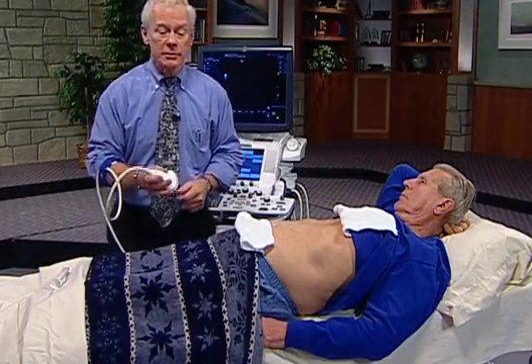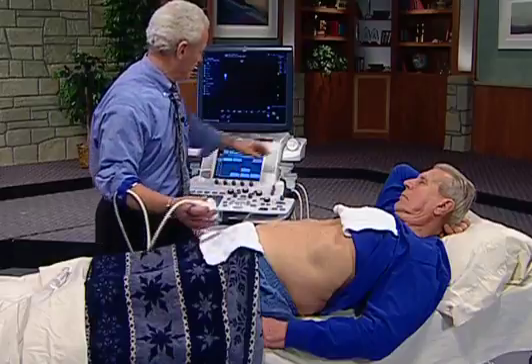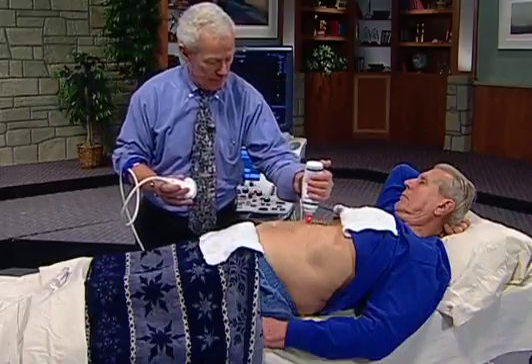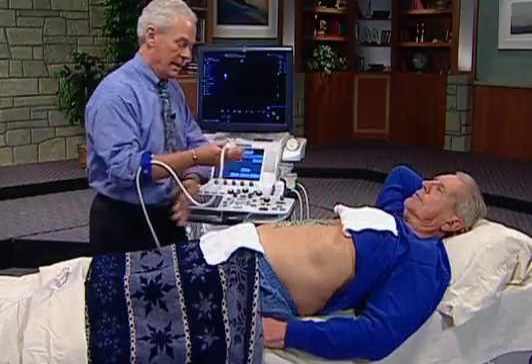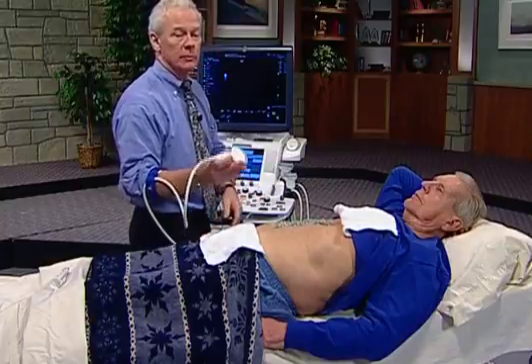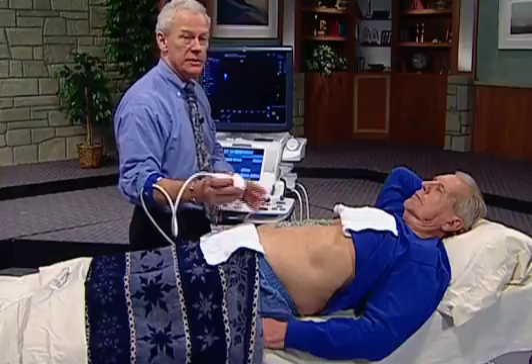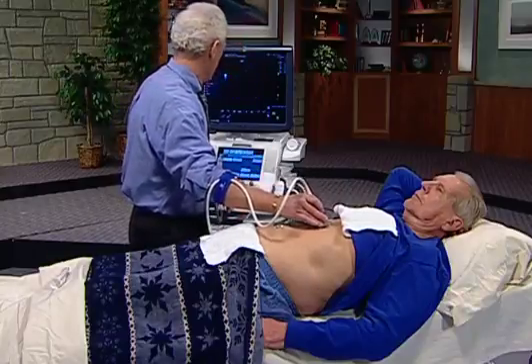Let's turn to the actual examination. We have the patient lying supine. We'll liberally apply gel down the midline to start with. And I like to start the examination with a brief cursory review in black and white B-mode imaging and color Doppler, just to get a feel for the anatomy and what we're going to be up against.